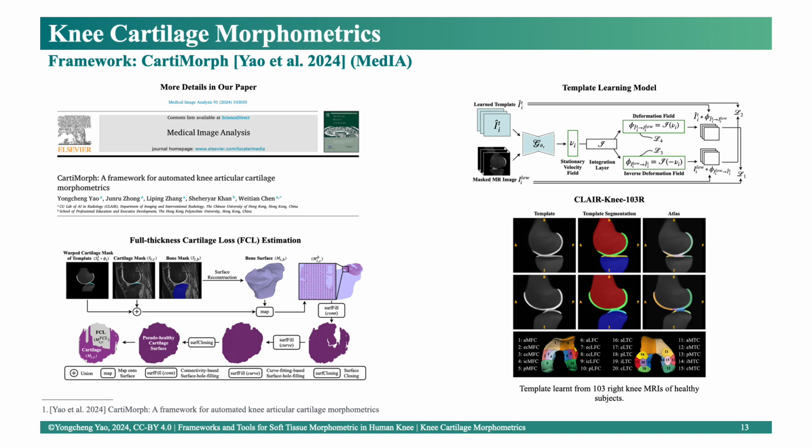The figures in this slide show the network architecture of the template learning model, the learned template images, and the proposed lesion quantification algorithm. For further methodological details, experimental setups, and results, please check our paper.